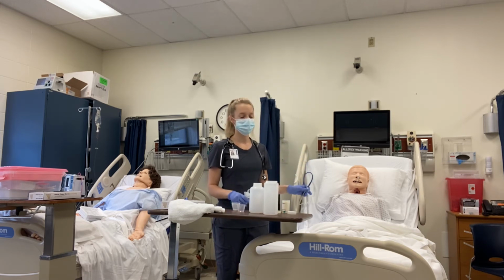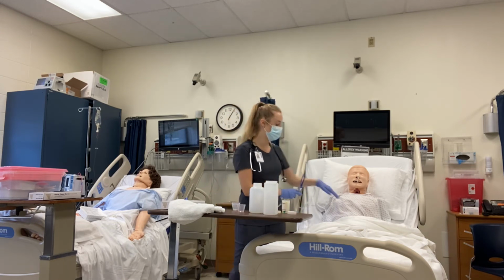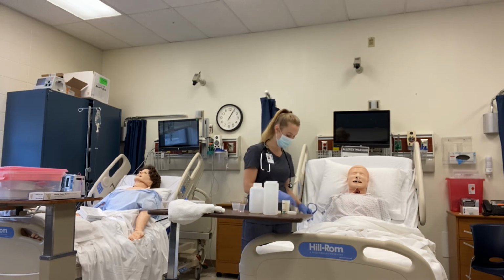I could have also checked this placement with an x-ray, which is the gold standard, or inserted about 10 to 30 mils of air in here and listened over the epigastric region for a whooshing noise to make sure that it's in the stomach. All right.